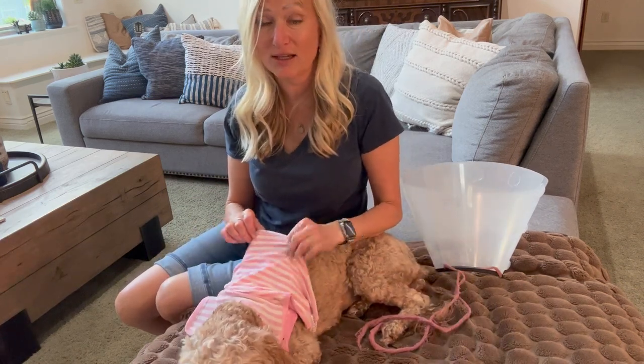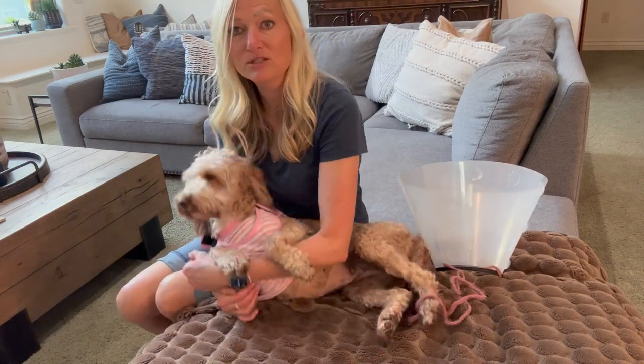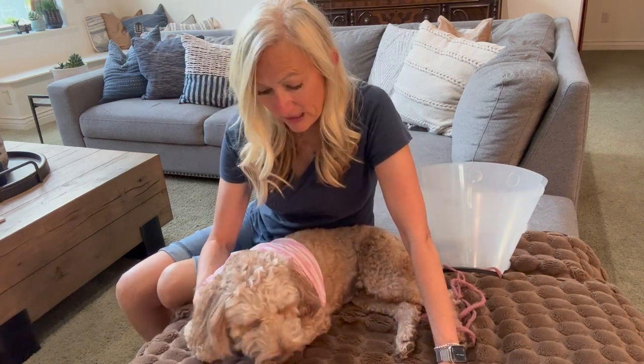This has been a game changer for us. She's much happier than wearing the cone and her incision is doing great. Just about another week and then she'll be free and all healed up.